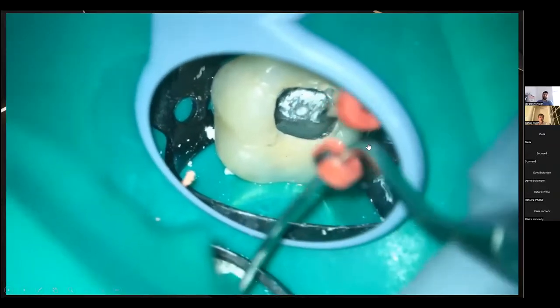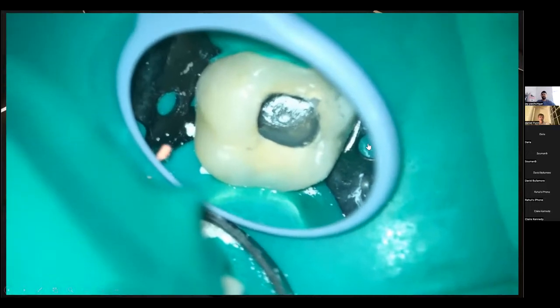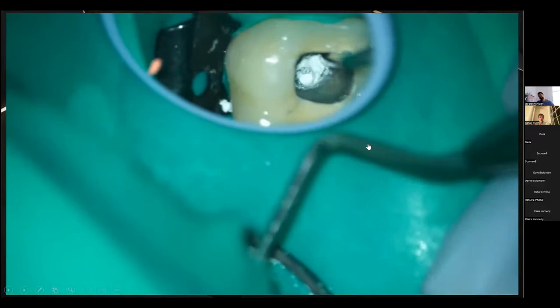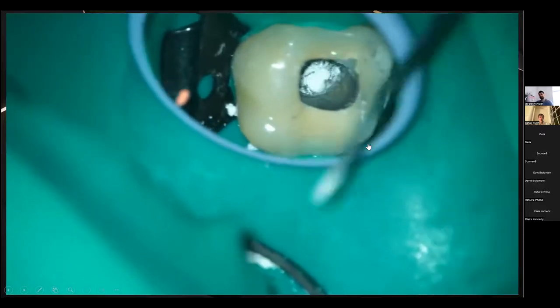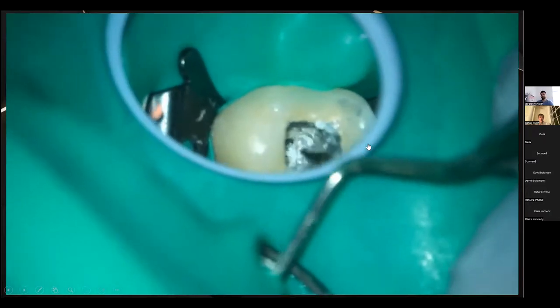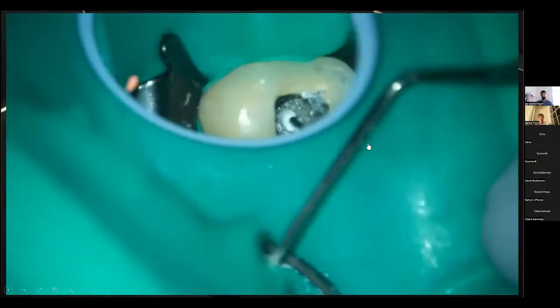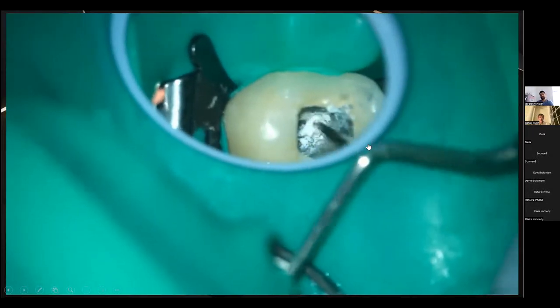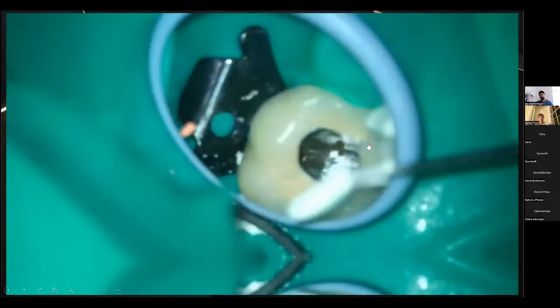And I think the same with, so actually on this tooth, I filled up the whole canal right the way through with the Bioceramic Putty. I think this guy was 80, it's already a retreat. We're not going to be doing this again. If it ever fails, the tooth is coming out, so I'm not concerned on this case about potentially having to retreat it in the future.